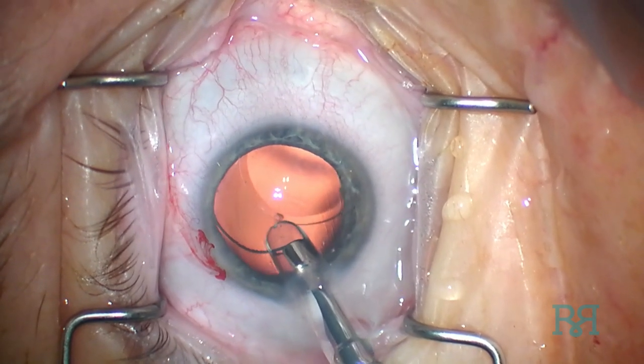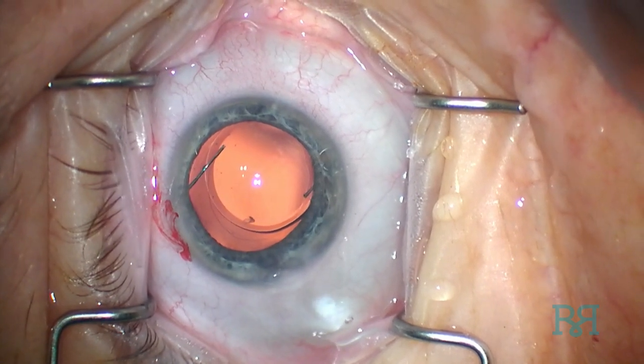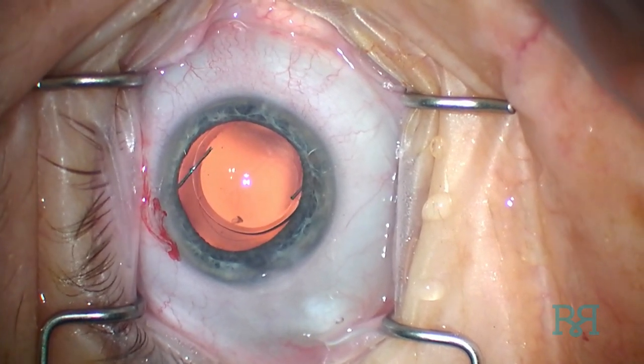Although initially daunting, I have found that this particular technique has resulted in easy placement of the IOL on a consistent basis over 90% of the time.